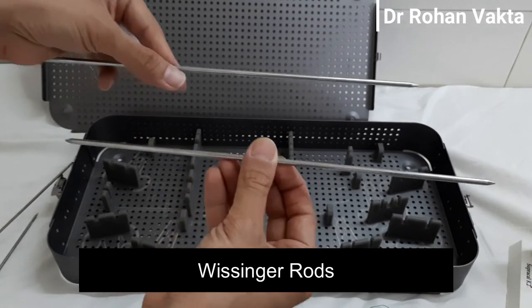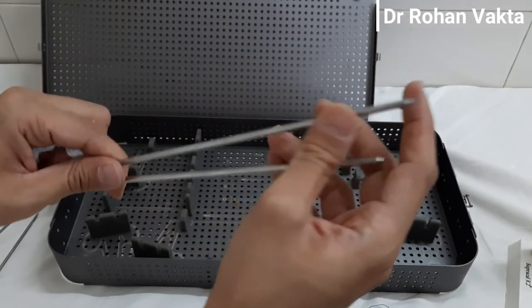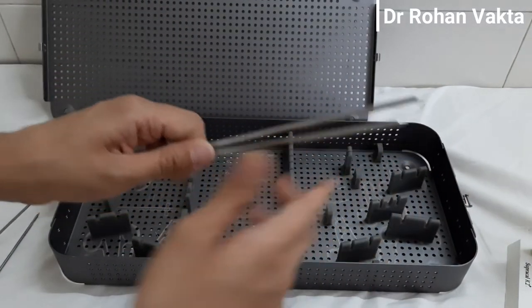These are Wissinger rods. You should usually keep two Wissinger rods. These are used to create a portal and for switching between portals. The tip should not be very sharp, to prevent soft tissue damage.